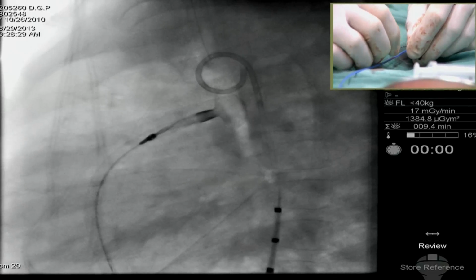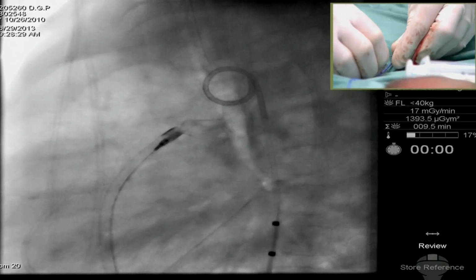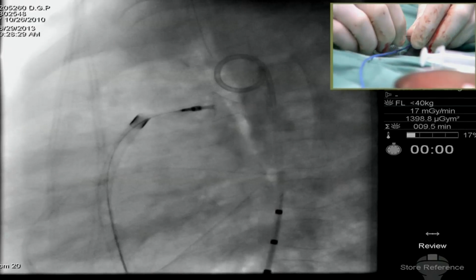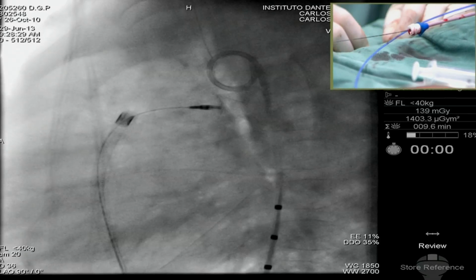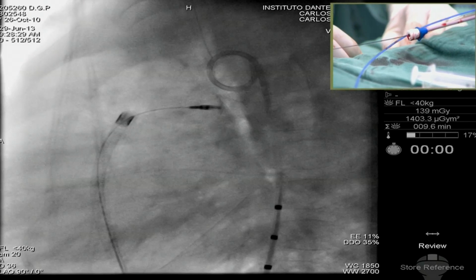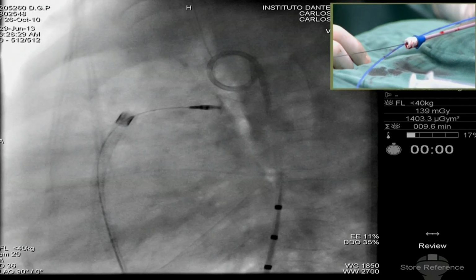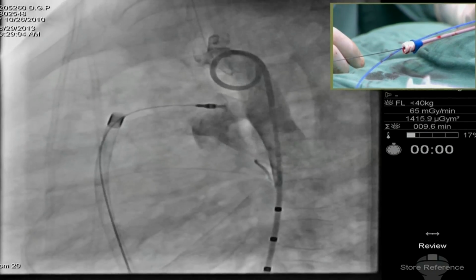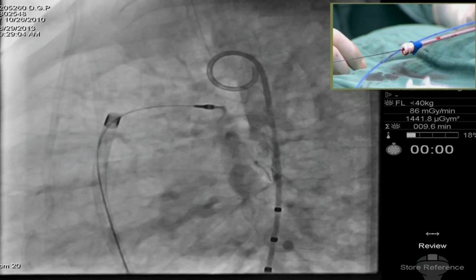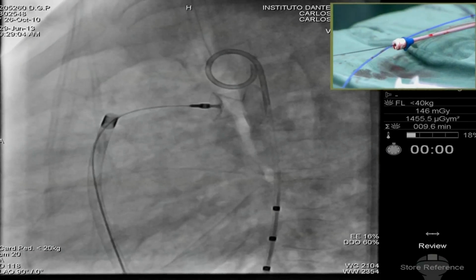I think on the RAO there was a suggestion of posterior indentation of the aorta. Exactly. So we have to be careful here. Exactly, because the disc outside the body is flat. But if it is too large and is put into a cylinder, which is the aorta, it cannot be flat anymore. Yep. That looks bulky. How does it look, guys? It looks bulky on the lateral view. You might have to have a look on the RAO.